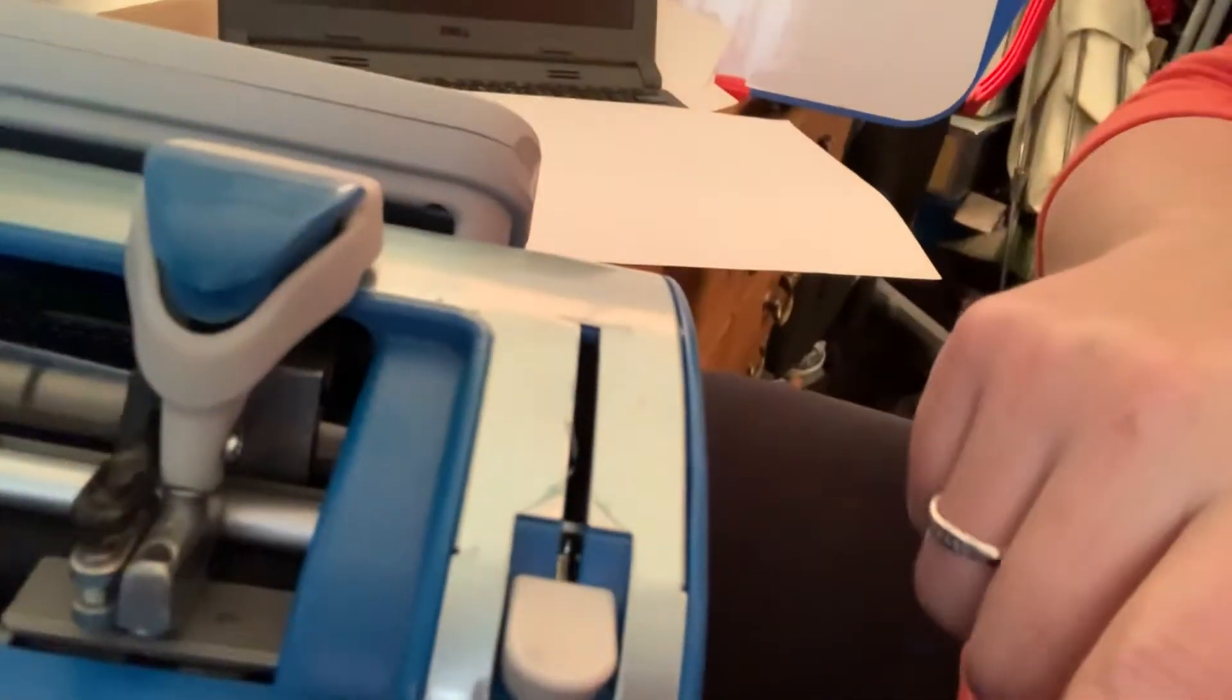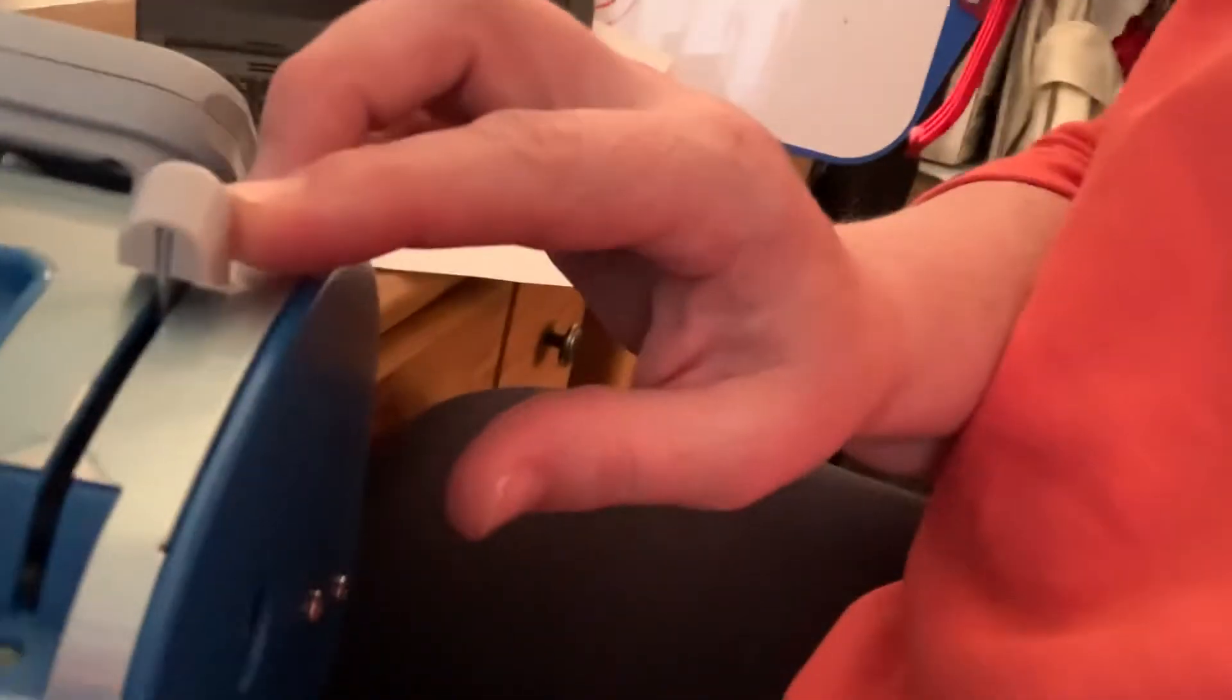When we put the paper in—I'll show you how to do that another time—but this locks it in place on both sides. I always like to make sure I do it on this side. And this is what we call the carriage.